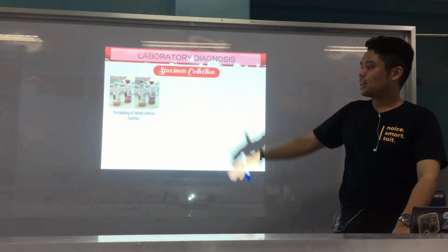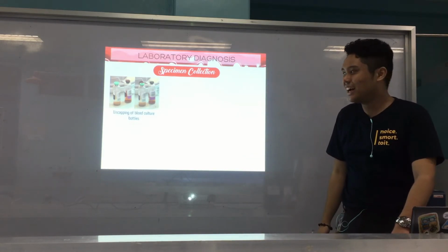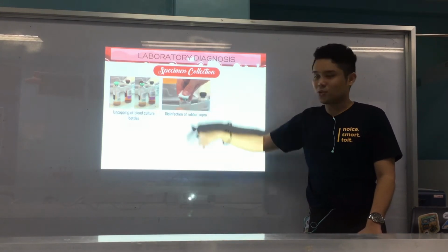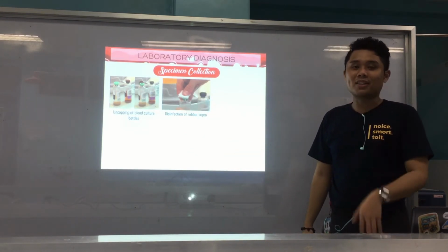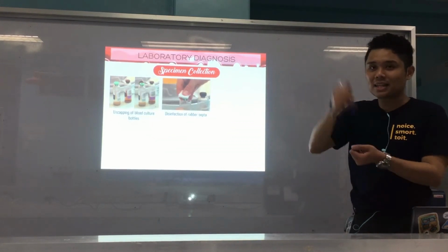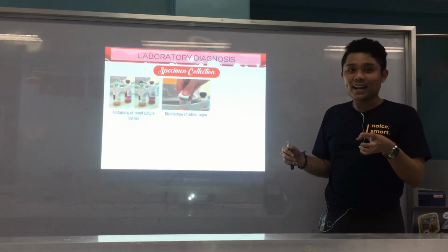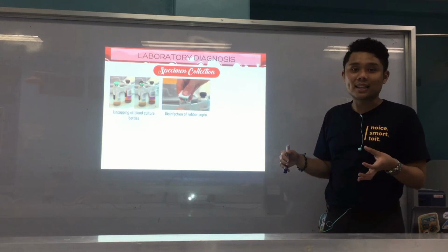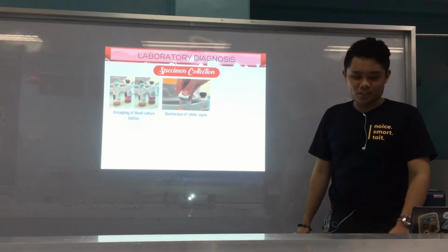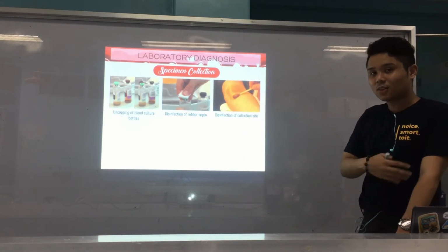Again, your blood culture bottles, imo siyang tantangon og cap, of course, kung saan mo pagsulod. Then, of course, disinfect the rubber septa or kaning sa taas. Of course, we want to disinfect. Again, limit the contamination. So, kaning siya, guys, kaning murag gray sa tunga, that's rubber. So, mapansak na siya. Mura siya kanang rubber na taklob sa inyuhang vials, gani, katong gigamit nato for water back test sa public health, katoy, nato siya na pagka-rubber. Okay, so mapansakan na siya syringe. Alright.